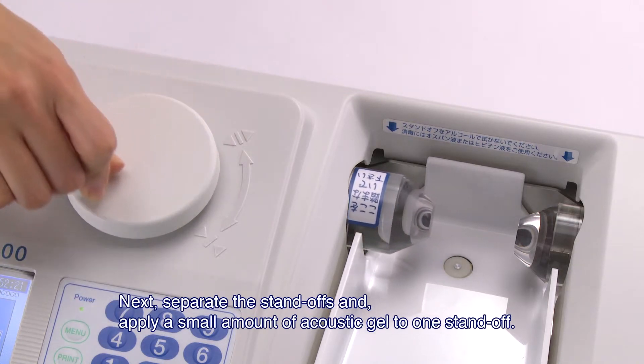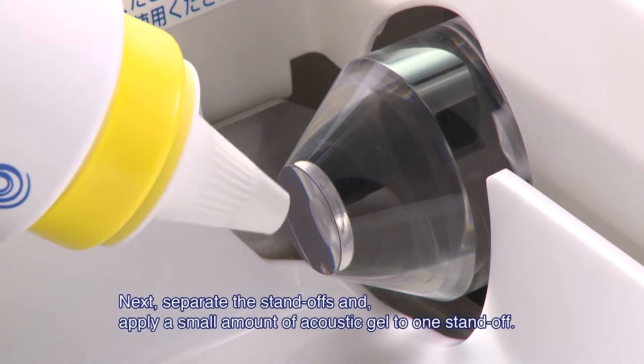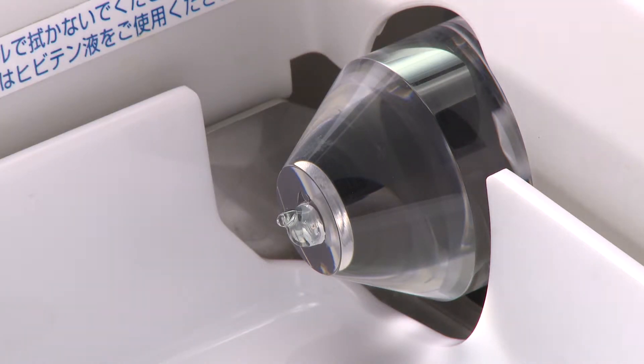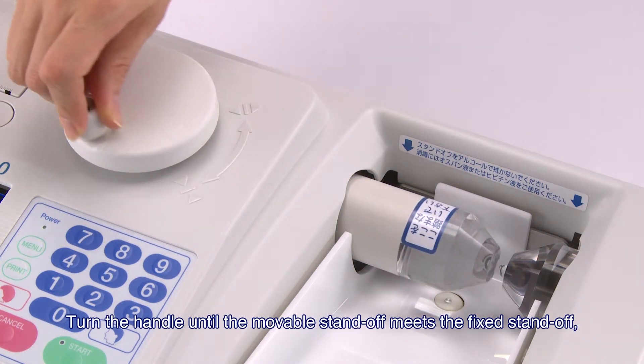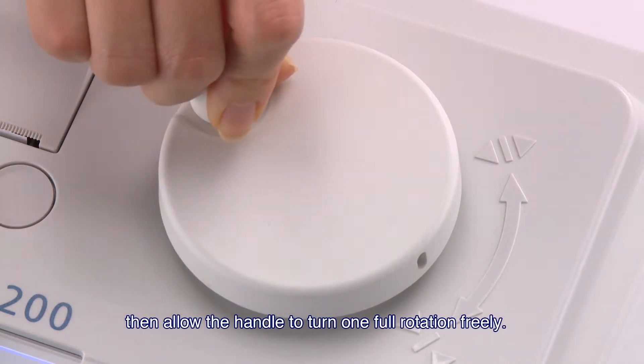Next, separate the standoffs and apply a small amount of acoustic gel to one standoff. Turn the handle until the movable standoff meets the fixed standoff. Then, allow the handle to turn one full rotation freely.